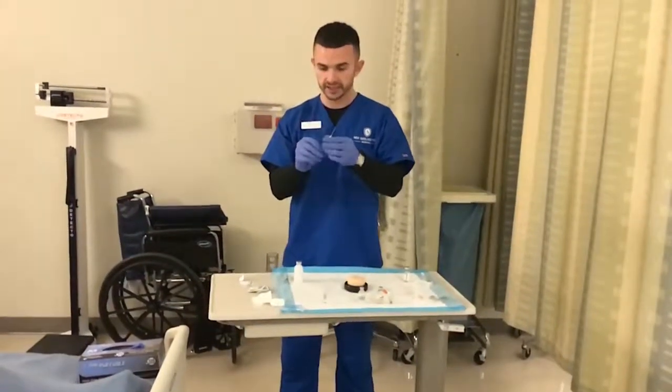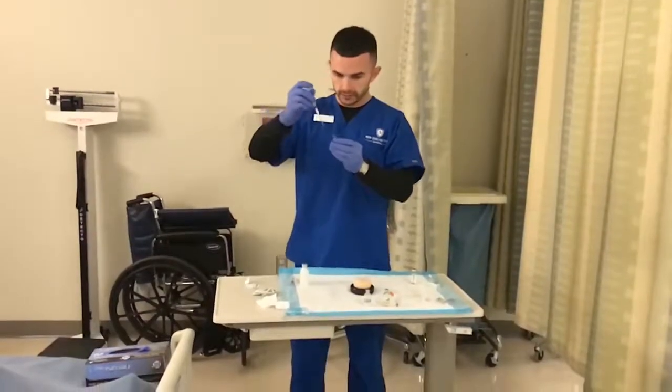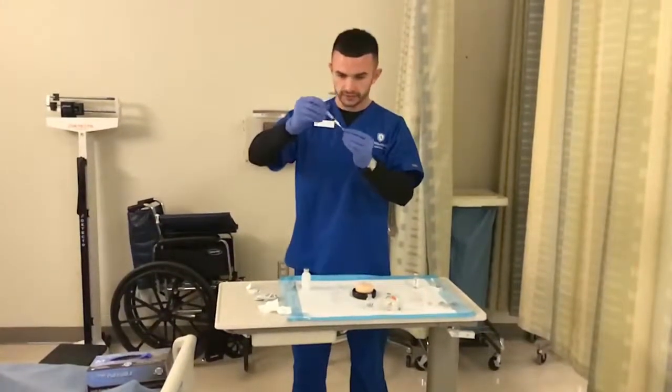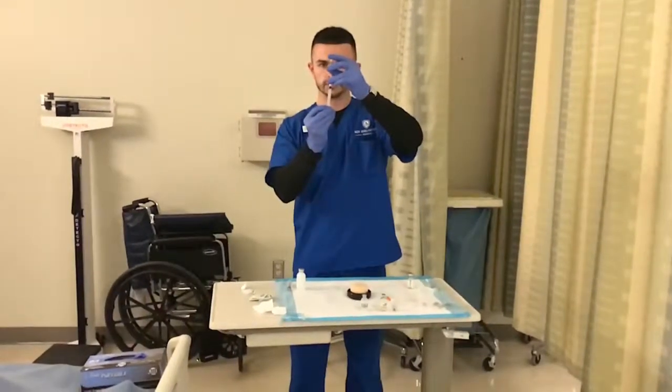So first, I'm taking my clear syringe head, we want to call it my filter, and I'm inserting that, flipping it over, and we'll say we're drawing up 1 milliliter.